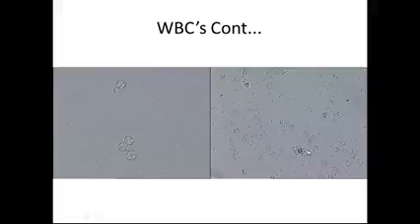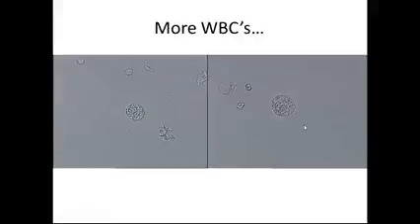With white blood cells on a slide, you will also almost always note the presence of bacteria also on those slides. So here, these little dots, little slits, are all bacteria that are in the urine. So they are all over the place generally when white blood cells are present. So here are some more examples of white blood cells. So granulation, here are some with the nucleus that you can see.